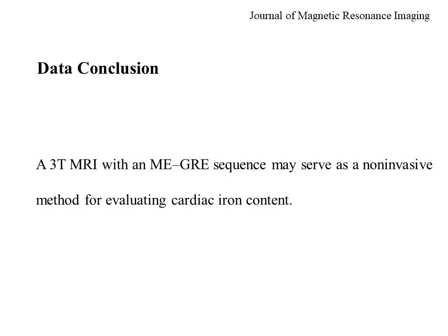Conclusion. A 3T MRI with a multi-echo gradient echo sequence may serve as a non-invasive method for evaluating cardiac iron content.